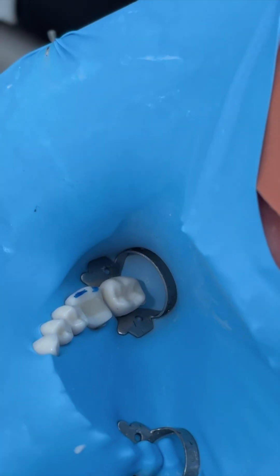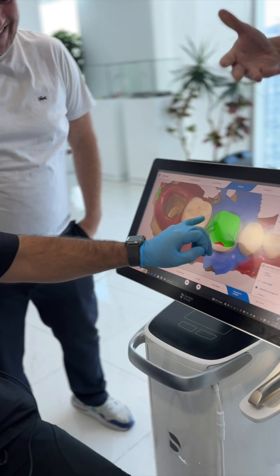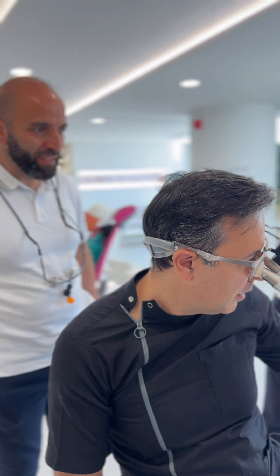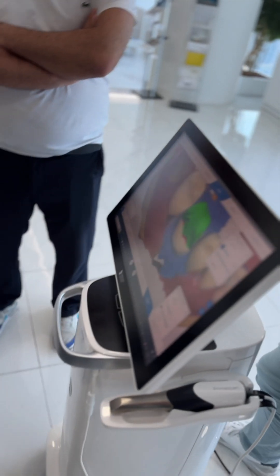For example, in the preparation, see this margin here — this is my opportunity to also refine the preparation itself. Not only to reduce where I don't have space for the ceramic, this is also an opportunity for me to reevaluate. How about 0.3 — let's say, to be safe.